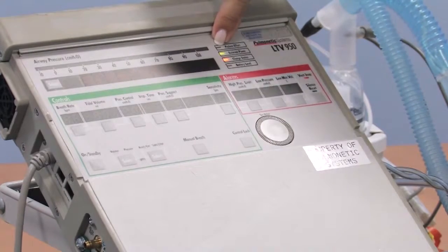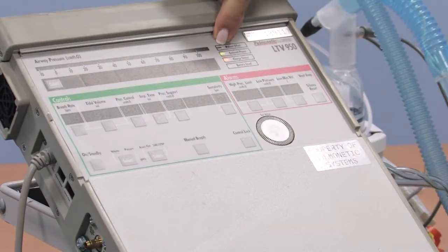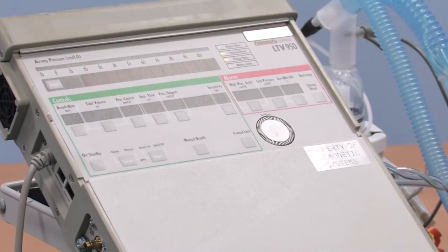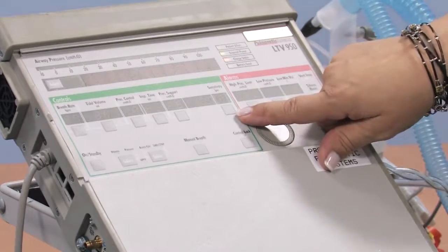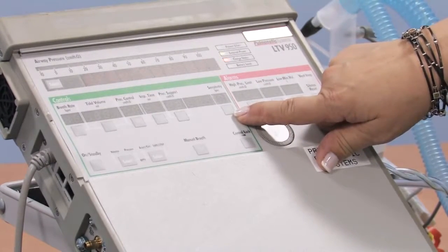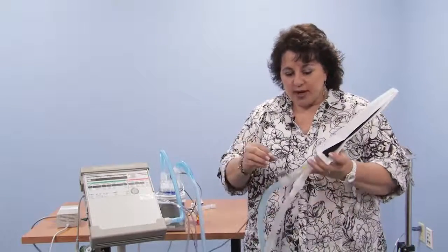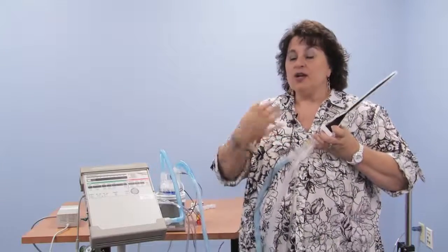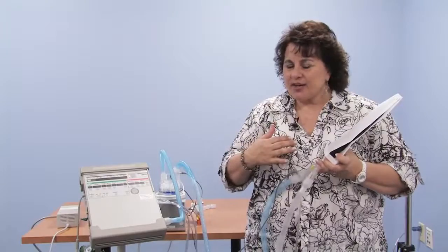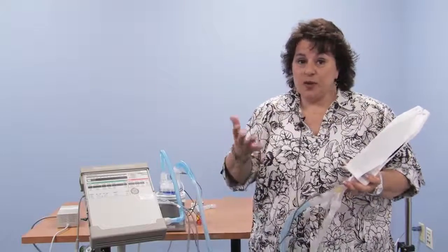Sensitivity is how your child says, I want a breath. It corresponds to this patient effort light up here. So when I say I want a breath, the light flickers, and based on how easy or hard you've made it for me, the child, I can turn it on. 1 is the very easiest, so your child barely has to move, only 1 liter of gas right from here, to say, okay, turn on, I want a breath. 9 is the hardest. So you might say, well, Lauren, why would you want to put my child on anything other than 1? Because if 1's the easiest for my child to breathe, I want my child on 1.